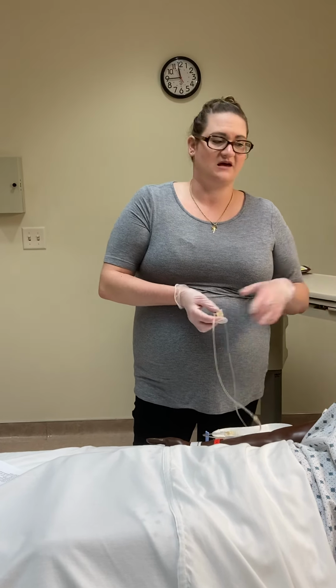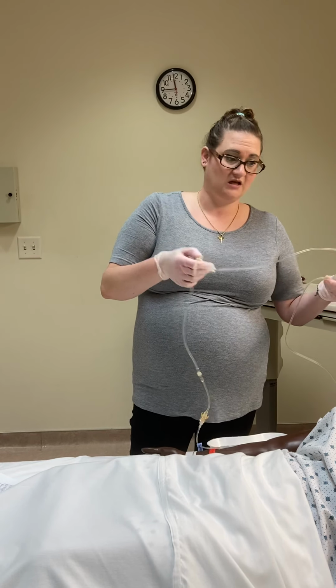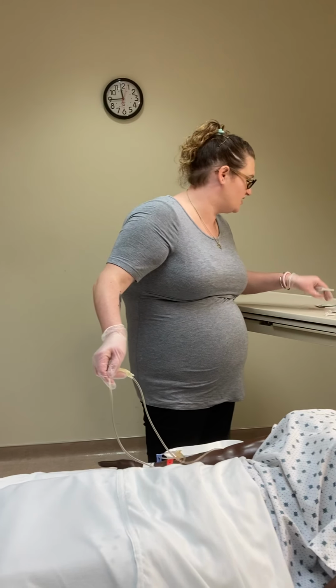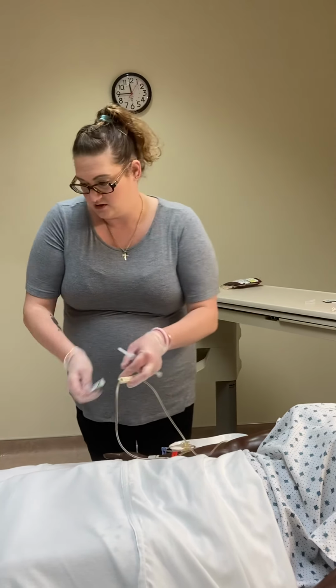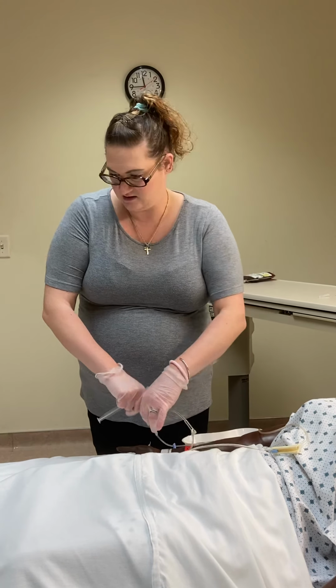What we're looking for is that if you see a reaction or your patient complains of pain, or you see a variability in the vital signs, we're going to stop this infusion immediately. We're going to stay with our patient. We cannot leave our patient alone. We're going to get a fresh set of vital signs.